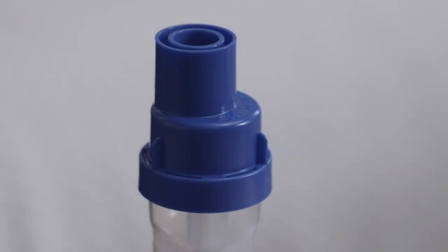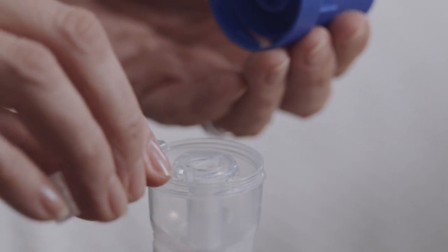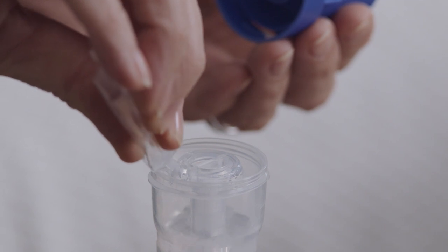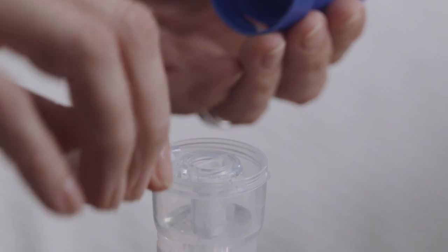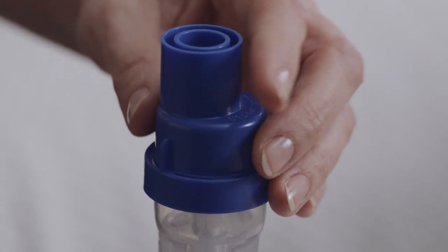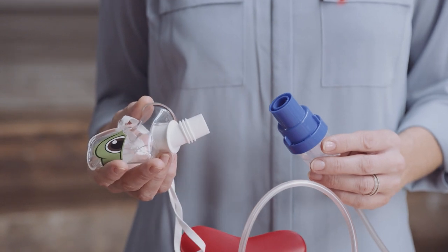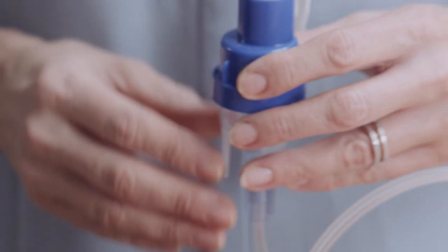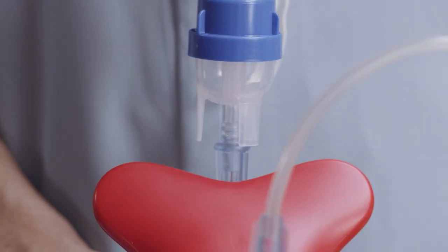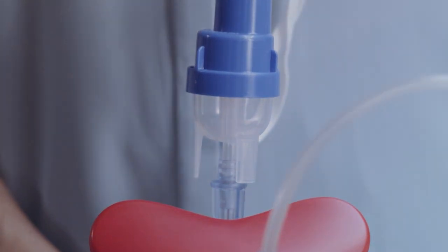When you're ready to add the medication, unscrew the top of the Sidestream nebuliser cup and pour in the prescribed medication. The Sidestream nebuliser cup is suitable for 2 millilitre to 10 millilitre doses. Screw the top back onto the nebuliser cup and attach either the nebuliser mouthpiece or the face mask. Don't lay the Sidestream down on its side because the medication will spill out. You can use the parking post on your device for securing the Sidestream when not in use.